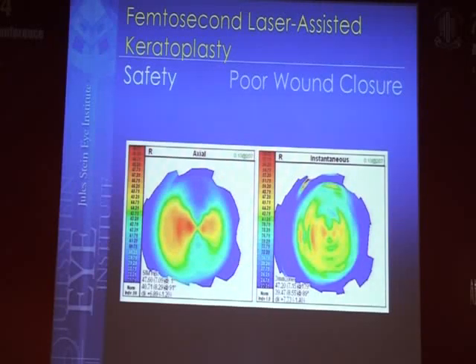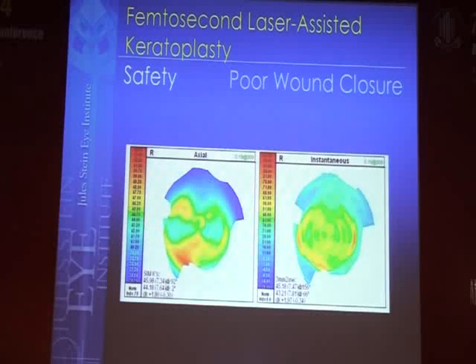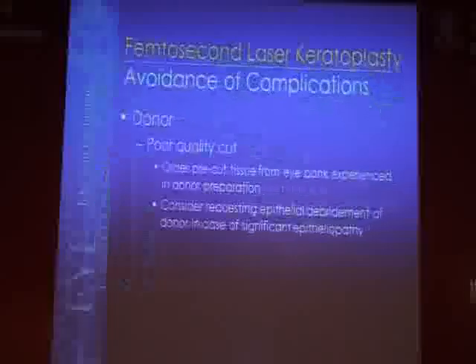But in this case, the femtosecond laser saved me because I performed a femtosecond astigmatic keratotomy and got the astigmatism down to 1.8. So a good save there.